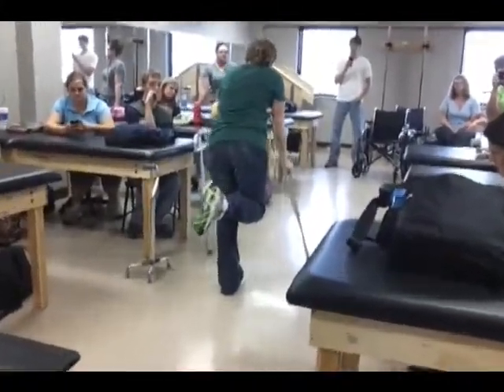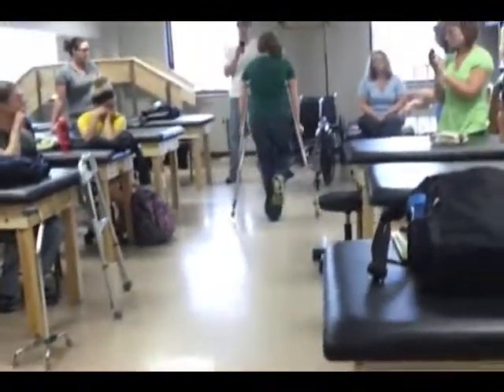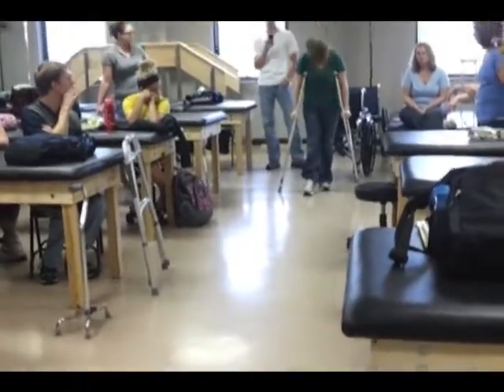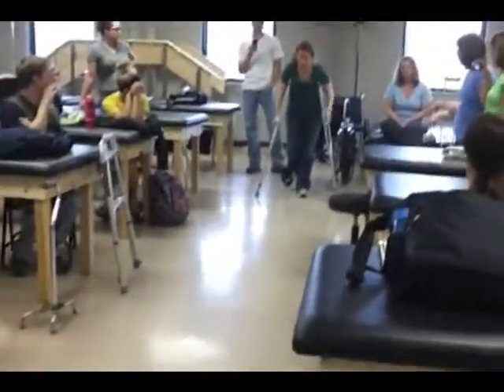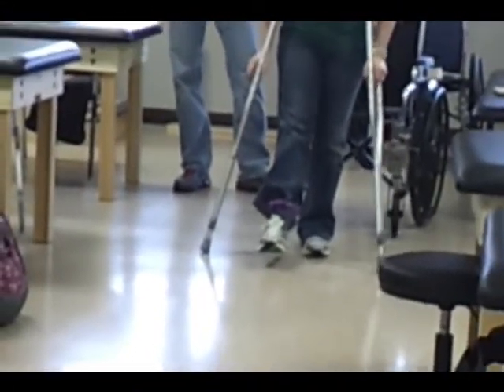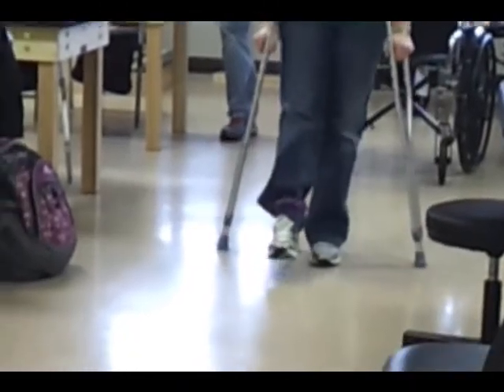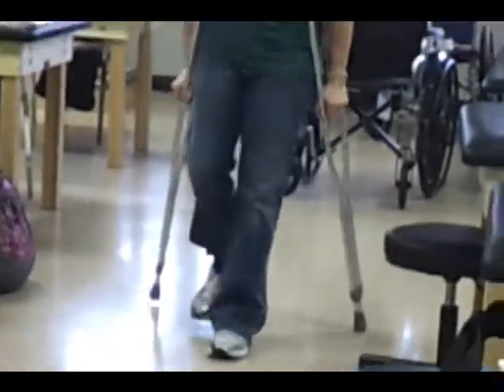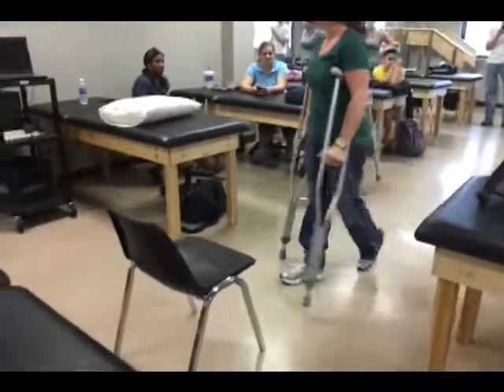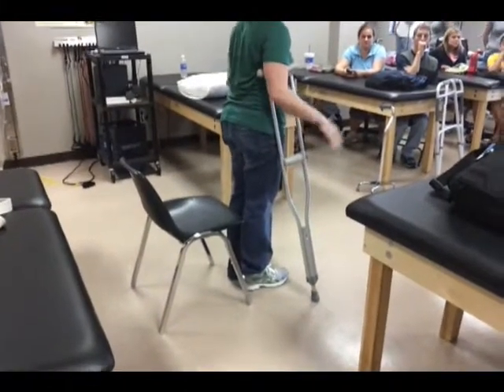Notice I'm not up here, because it doesn't replicate a more typical walking pattern with my foot up there. So try and encourage them to be as close to a typical gait pattern as you can. I can either do a swing to or a swing through. The swing through is quicker, but it's probably a little less stable. But either way, it's a 3-point gait pattern.